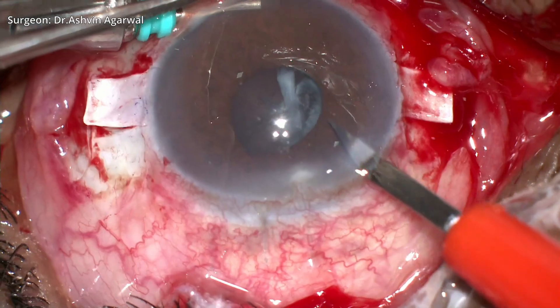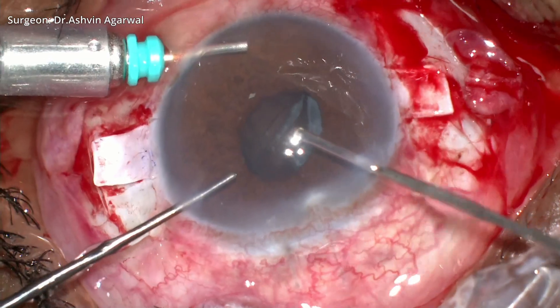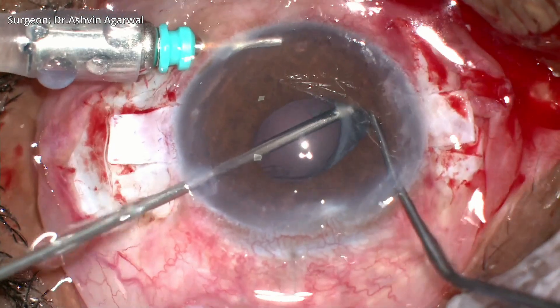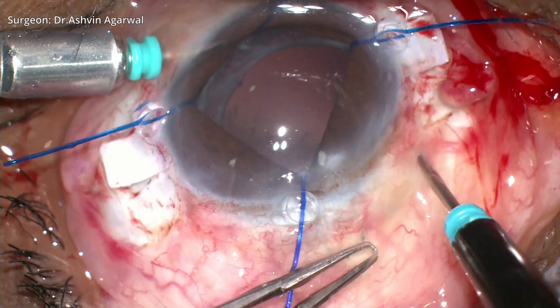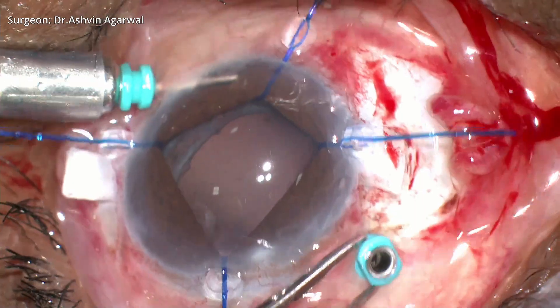A side port entry is made and a 25-gauge vitrector is used to remove the residual cortex. As the pupil is small and due to poor visualization, we decide to use iris hooks. Vitrectomy ports are then made and after access to the posterior segment, which is stained with triamcinolone, thorough vitrectomy is done to ensure there are no adhesions to the IOL.